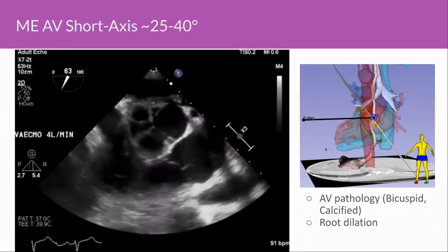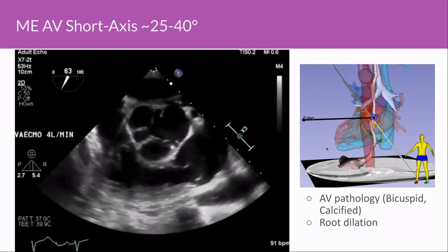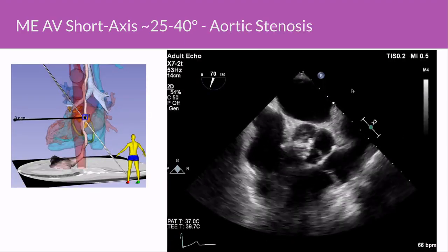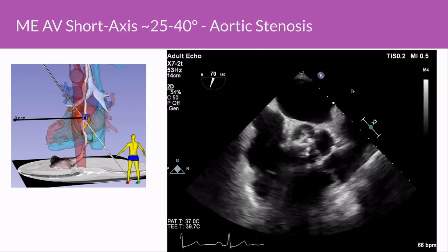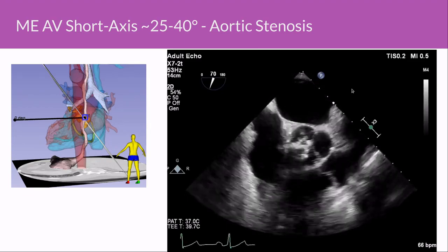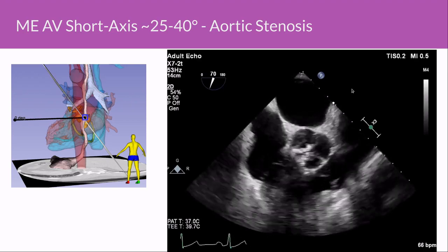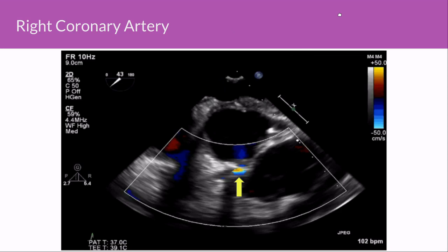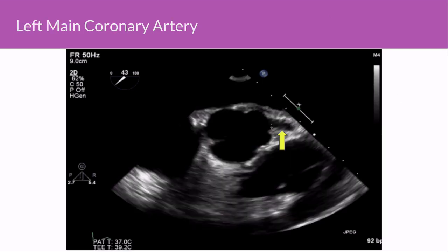Here is a normal example — the aortic valve in short axis, the pulmonary valve in something close to long axis. This is an example of a severely stenotic aortic valve, functionally bicuspid, with the commissure between the left and non-coronary cusps not opening, and very thickened leaflet edges with very limited opening. We also demonstrate imaging of the RCA, which can be quite challenging and becomes easier with color Doppler, and the left main coronary artery — where you can often see the bifurcation into the LAD and circumflex.